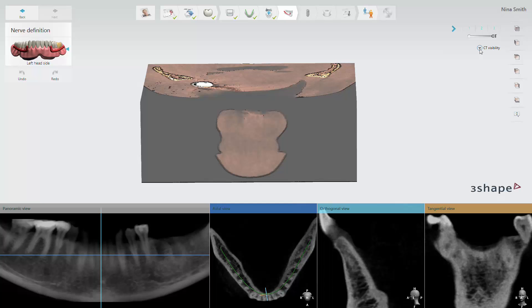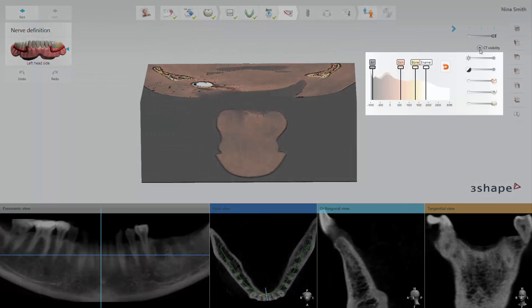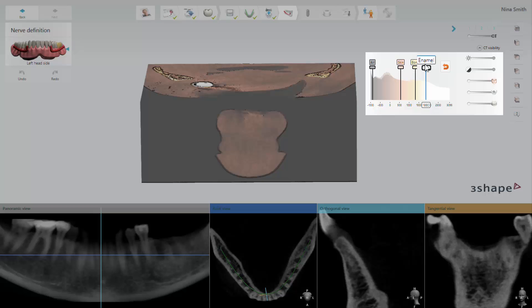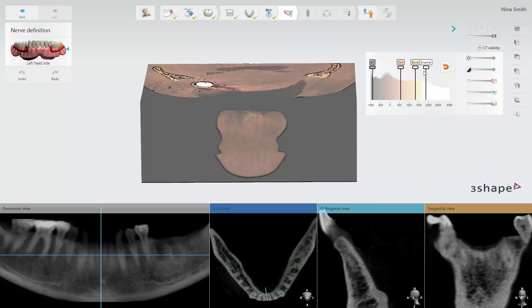In Implant Studio we have defined some of the materials: air, skin, bone, and enamel. They are positioned on a scale according to the mineral saturation level and shown in Hounsfield units. For each material, a slider is available to adjust visibility.